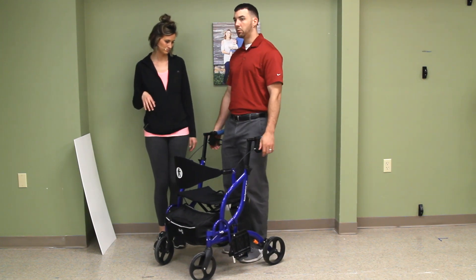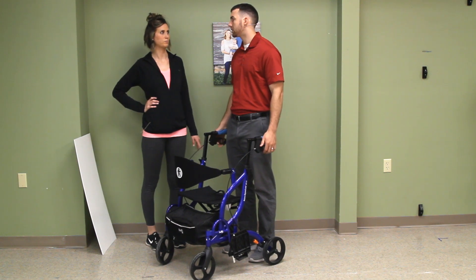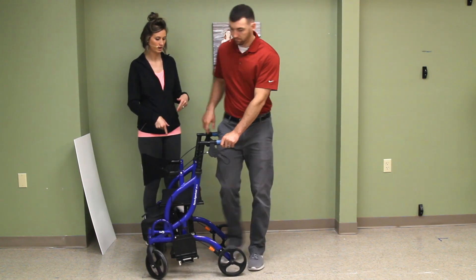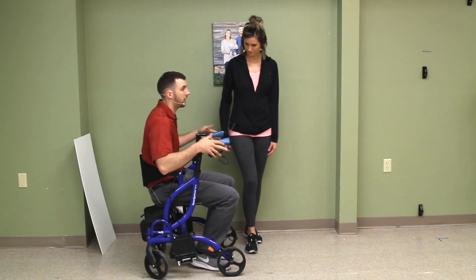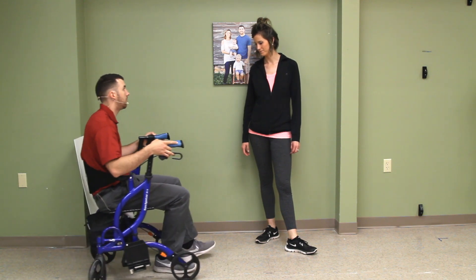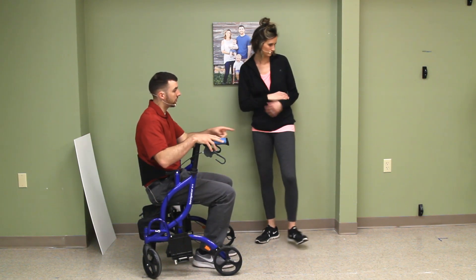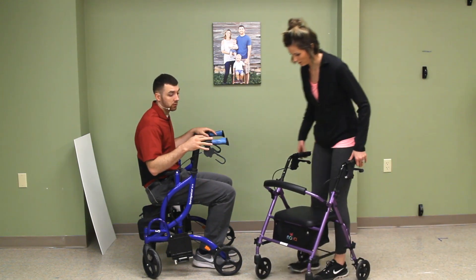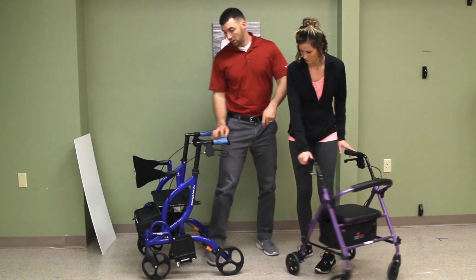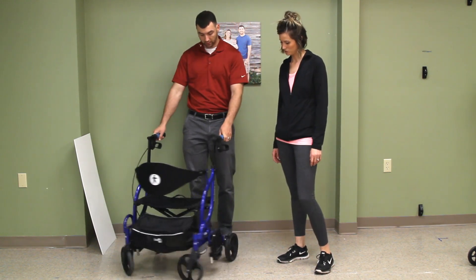Make sure the handles are adjusted to your height — up to about 6'4" or 6'5". The thing I love about this is the wheels are a lot bigger. You can just tell from the side — the wheels are so much bigger, much better made. They're good for uneven terrain, grass, rocks. The wheels swivel so it maneuvers very well and it's easy to push.